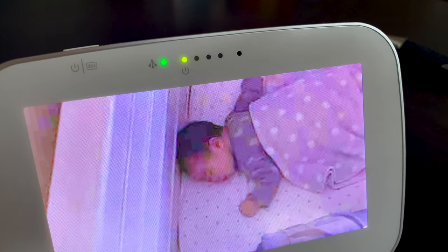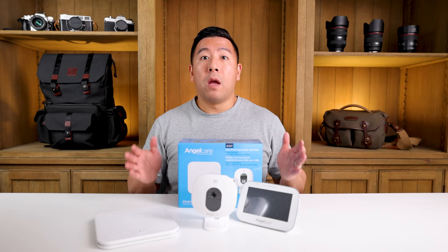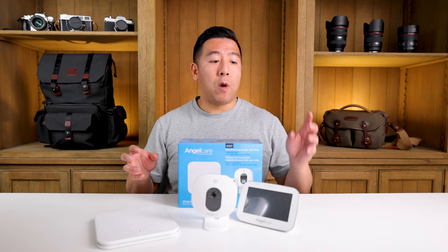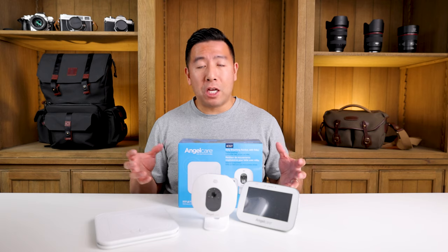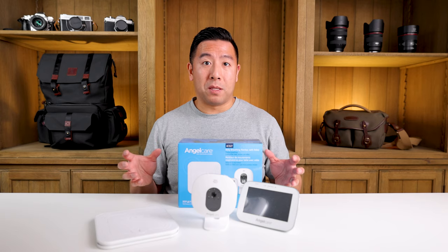Now, if your baby does stop moving or breathing, or if you pick up the baby and there's no baby there, in about 20 seconds it will alarm on both the camera and the monitor. Unfortunately, 20 seconds is a long time and you cannot change the duration — that is another negative feature.